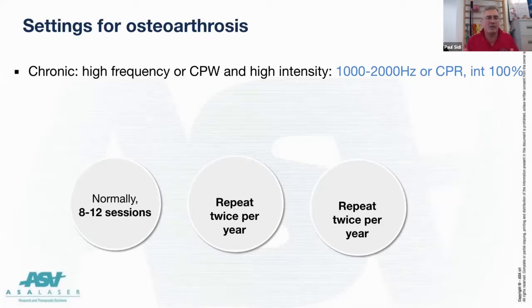I know it's very difficult sometimes, but then certainly try and get 2, 2, 2. And you'll see the treatment times are so short. We can get them in for half a session, charge them half as much, so they're getting exactly the same for the money. But there is the difficulty of people working. But now, with lockdown finished, a lot of people are working from home, so they should be able to do it.